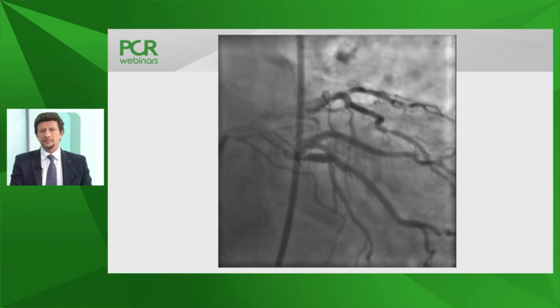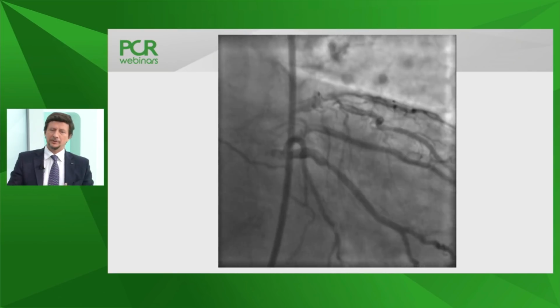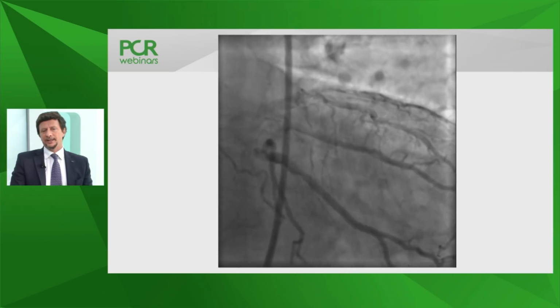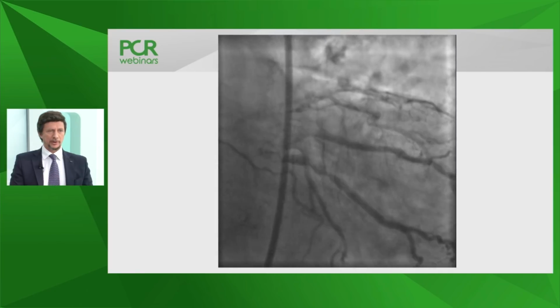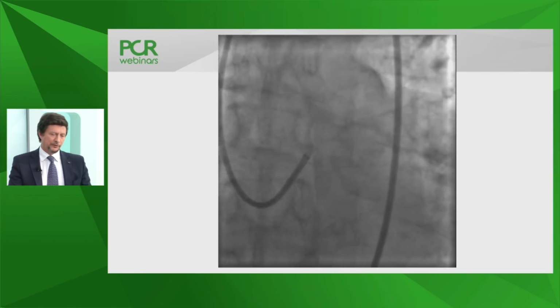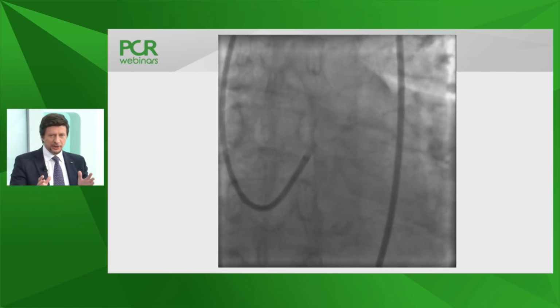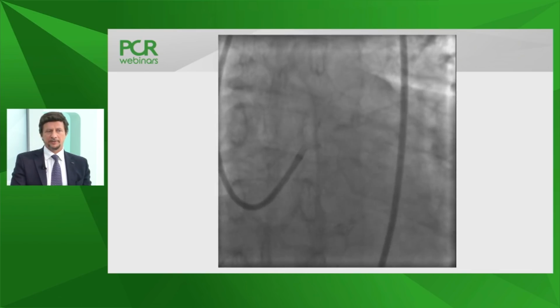There is another issue. This patient might need a temporary pacemaker in the right ventricle, so you need to work on the groin. And I wouldn't exclude that you might need circulatory support, and this will go for the groin. So at the time you're working on the groin, working with 1 or 2 groins is more comfortable than having a hand and a groin. So putting all this together, we went through the femoral with a 7 French extra backup catheter.